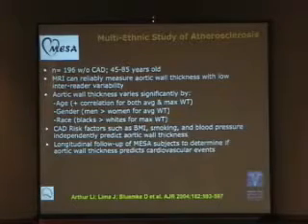So what are the findings? This is now in a setting that you want it to be. This is a multi-center setting, looking at subclinical disease, 196 patients, aged 45 to 85, showing that it's not only New York and Seattle that can do this, that MRI can reliably measure aortic wall thickness with very low inter-reader variability. And there's a wall thickness correlation with age, and interestingly also with gender and race. That's one of the important points of that study. But also that CAD risk factors such as BMI, smoking, and blood pressure independently predict aortic wall thickness.